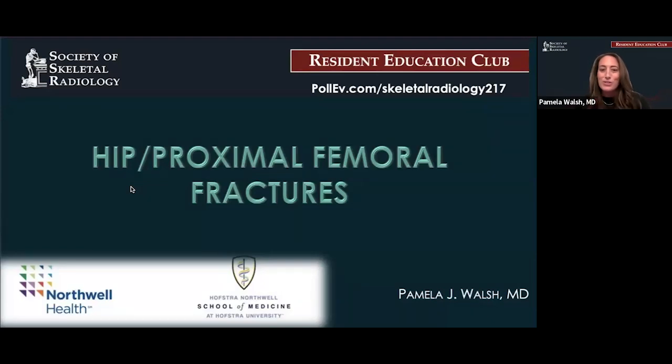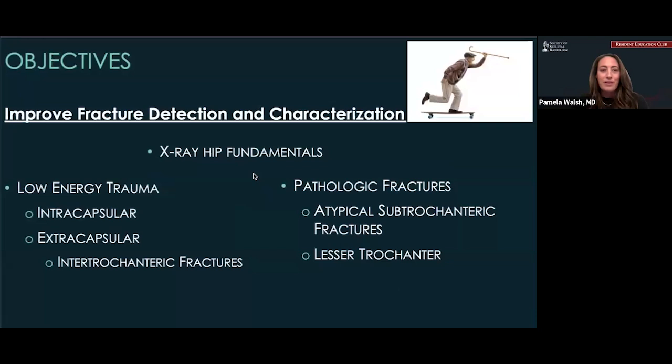So we'll get started. I'm going to be speaking on hip and proximal femoral fractures. For the goals of this talk, we're going to look at hip fractures and what we can do to improve detection of fractures, as well as how we should characterize them.